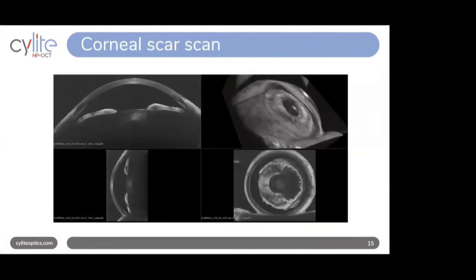And here I'm going to show a typical image. What we're looking at here is actually a montage of four images. The one on the top right is the three-dimensional image. And what I'm going to show is a video of basically that rotating and then looking at different scans through that, to pick up the other images.